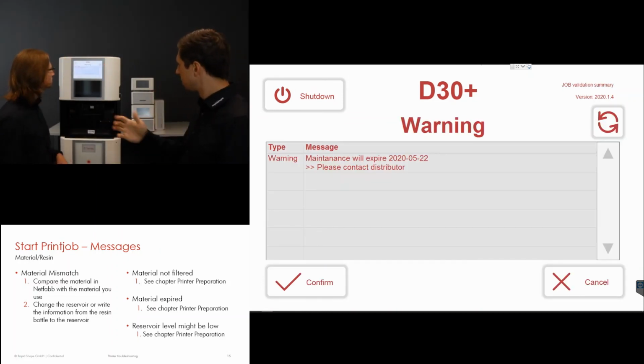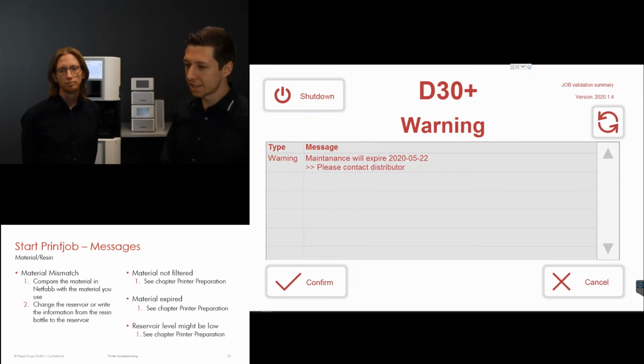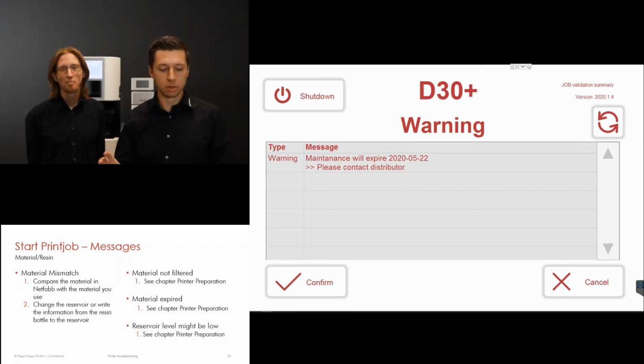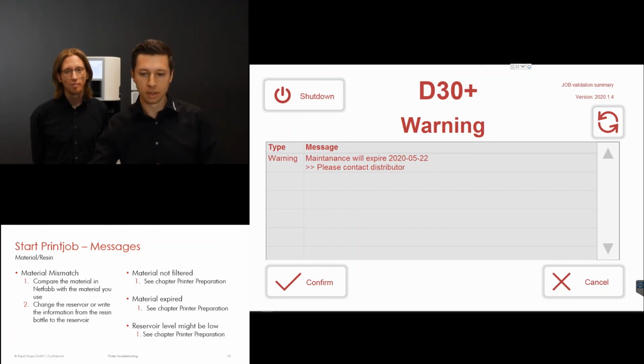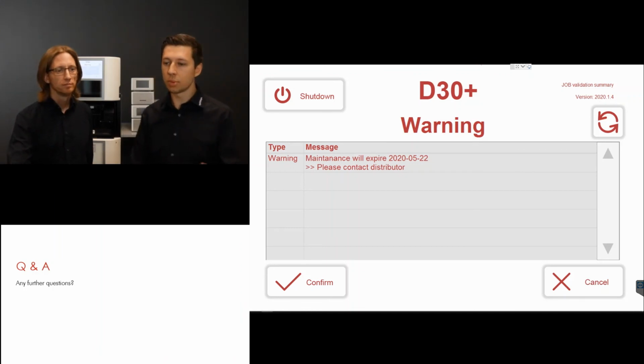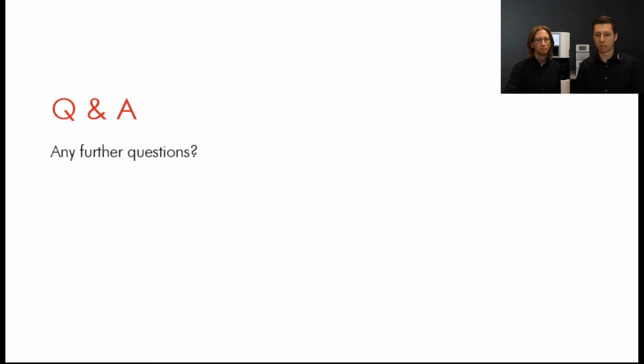So rechecking, wonderful, lovely. Only one issue is left. Maintenance will expire. We still have 8 days left to contact the RapidShape service, so good for us that they are next to us and they can do it real quick. Yeah. So now we solved all the issues, and I can see there are no questions yet, but let's head over to the big question and answer section. So now we could start, for example, the print job, because we're sure, okay, yeah, maintenance is another thing which RapidShape will solve, but I can print without any issues.